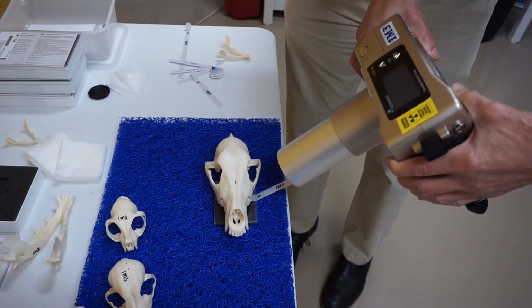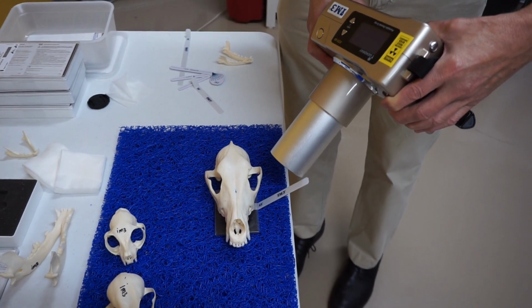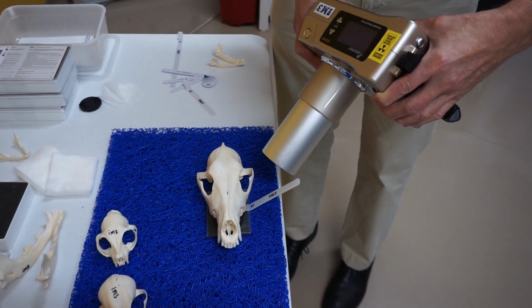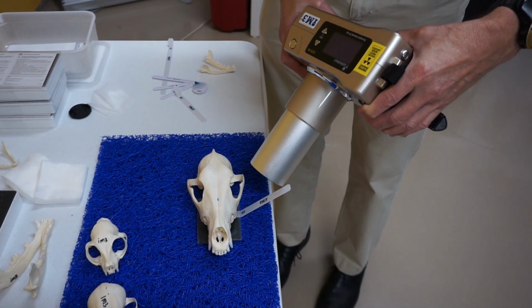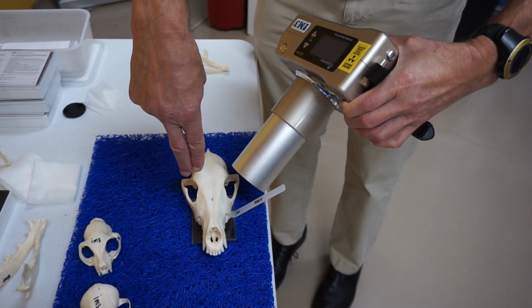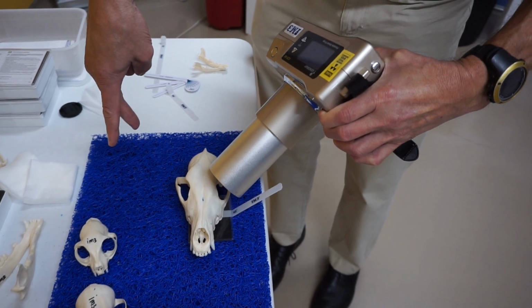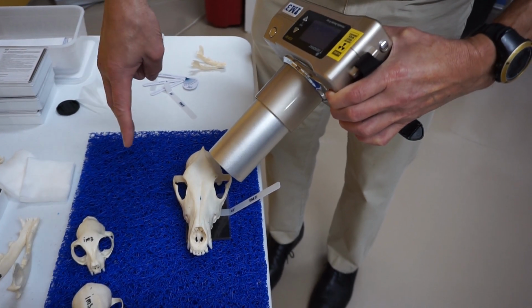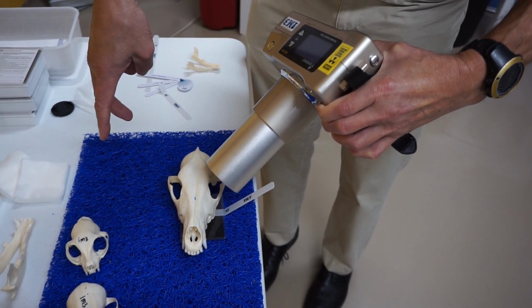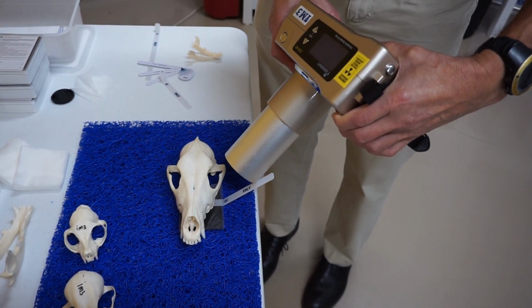so that's at right angles, and then we go to about 30 degrees, still at the 45-degree angle vertically, but now we moved it slightly caudally, so we're shooting from caudal to rostral. That will separate the mesial roots, so the mesiobuccal root will go forward, and the mesiopalatal root will go backwards. So that, in other words, the mesiobuccal root goes mesially or rostrally and the mesiopalatal root goes caudally or distally. So now we can actually separate those roots.